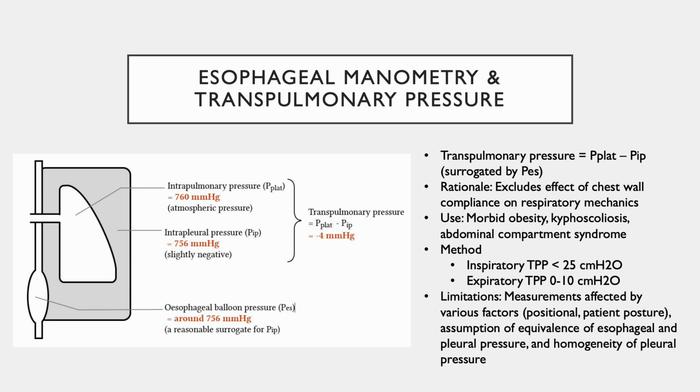On the expiratory side, the idea is to keep expiratory transpulmonary pressure out of the negative range because this will suggest predisposition to alveolar collapse. Hence, adjusting PEEP to inspiratory and expiratory transpulmonary pressure in the stated ranges limits distending pressures and minimizes alveolar collapse during tidal ventilation. Although conceptually attractive, this method suffers on the grounds of practicality.